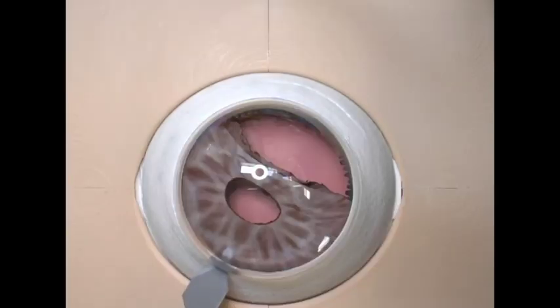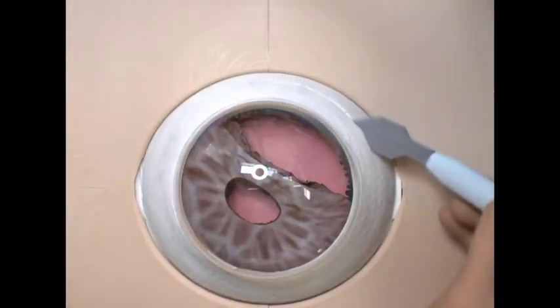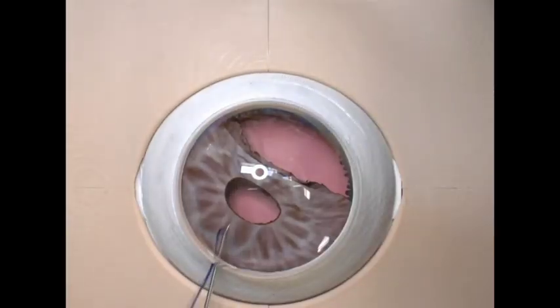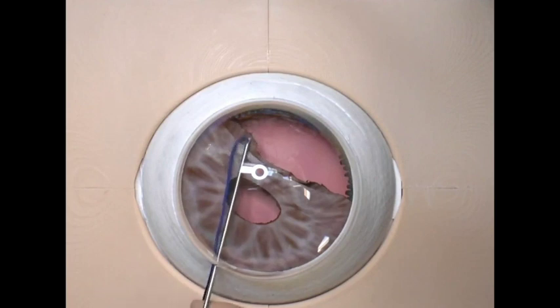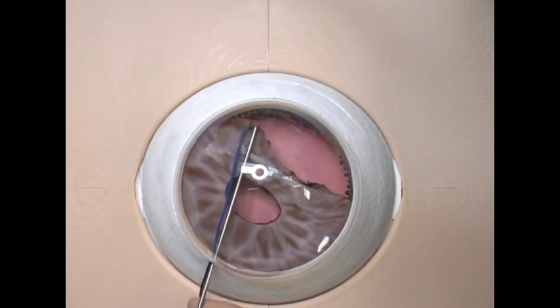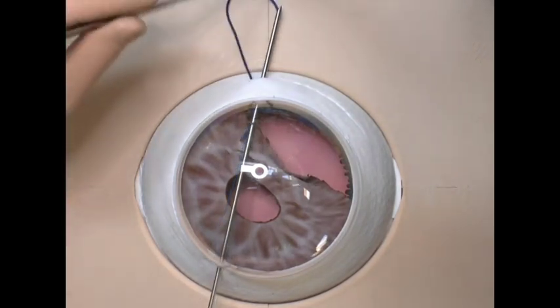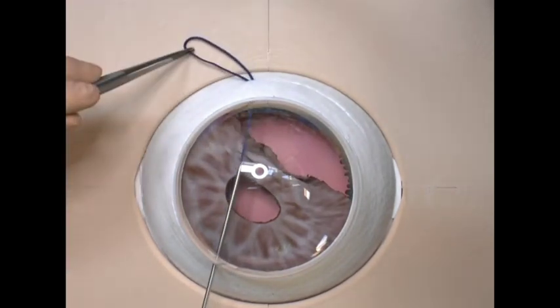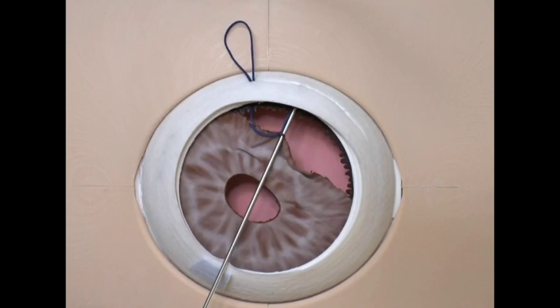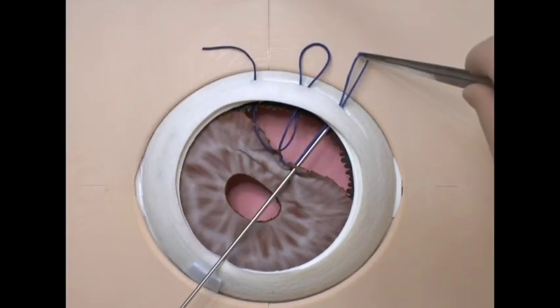A larger iridodialysis can be adapted either with multiple single interrupted sutures or with a sewing machine technique. The fiber is passed through a hypodermic needle by which we then suture the root of the iris repeatedly. We externalize the loops of the suture into the sclera groove where the single knot is buried.